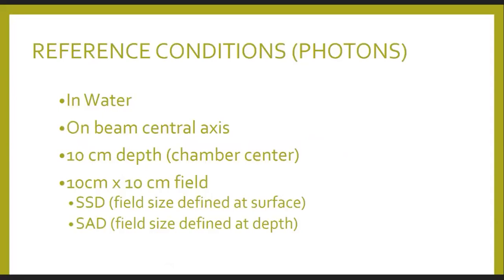The field size has to be 10 by 10. Whether we use the source to surface distance setup, SSD, that field size has to be defined at the surface. And for the source axis distance setup, SAD, that field size has to be defined at the reference depth or the measurement depth.